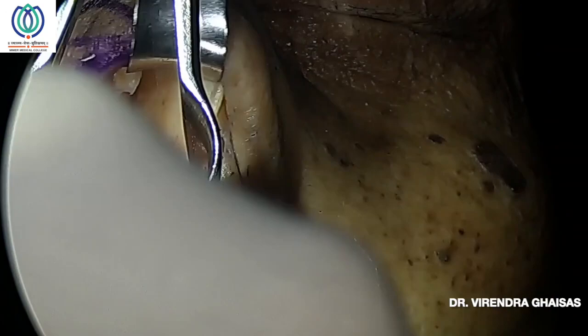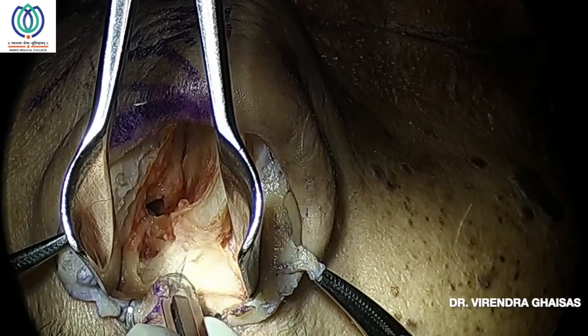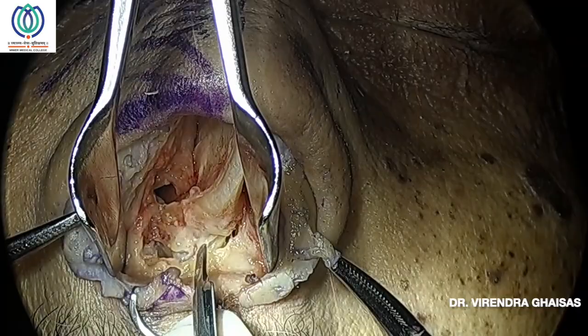Especially in rhinoplasty, when you want to harvest a lot of septal cartilage, then you keep this 1 cm. So you often do SMR rather than a septoplasty, so that you can harvest a large chunk of septal cartilage for grafting purposes.